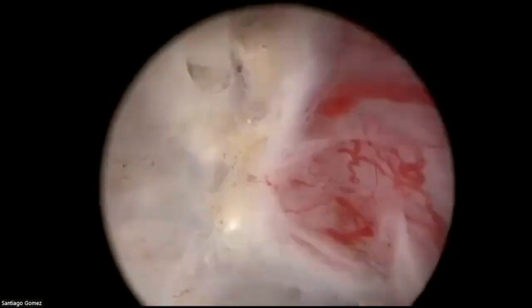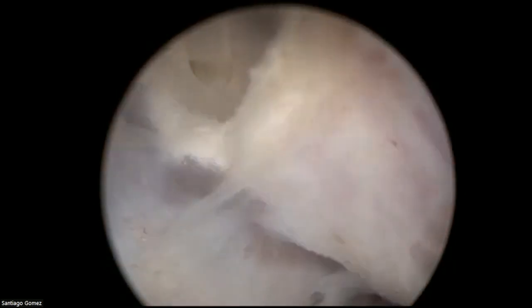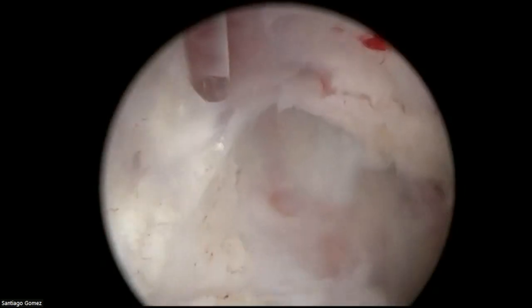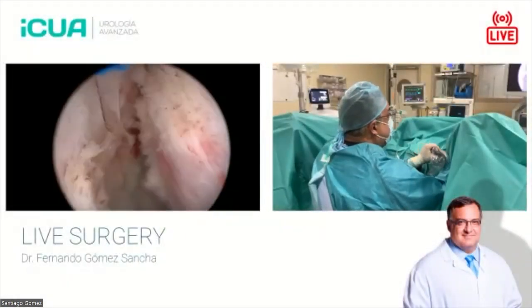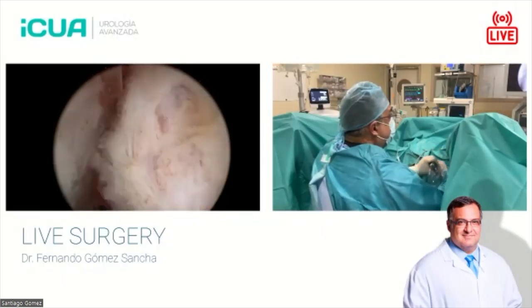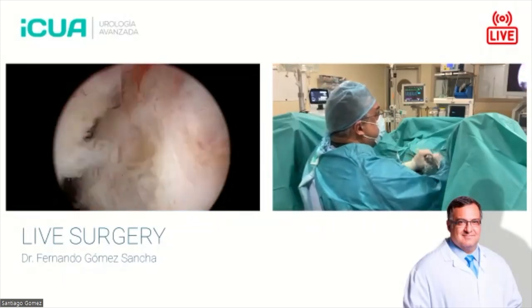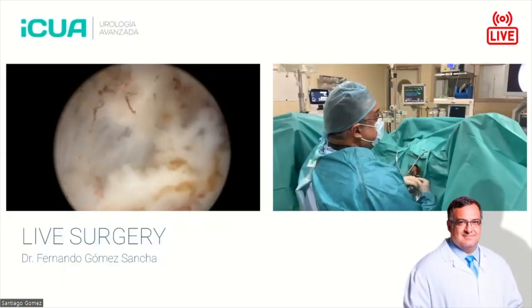Now I am starting to develop the lateral plane. Here you see that I'm going to take my dissection a little bit deeper into the direction of the bladder neck. This is what I call the mobilize and unconnect phase. Here, what I'm doing is mobilizing the apex. This apex was attached here and now I'm releasing it. So when I look up, I have some more information and better access. Here, this is the line anteriorly. So here, the access incision becomes more horizontal. You see here? There we are.